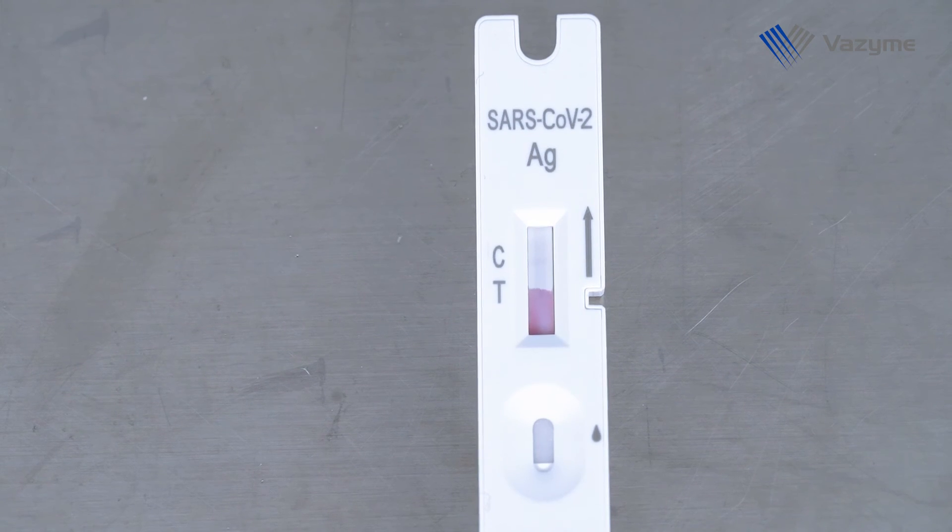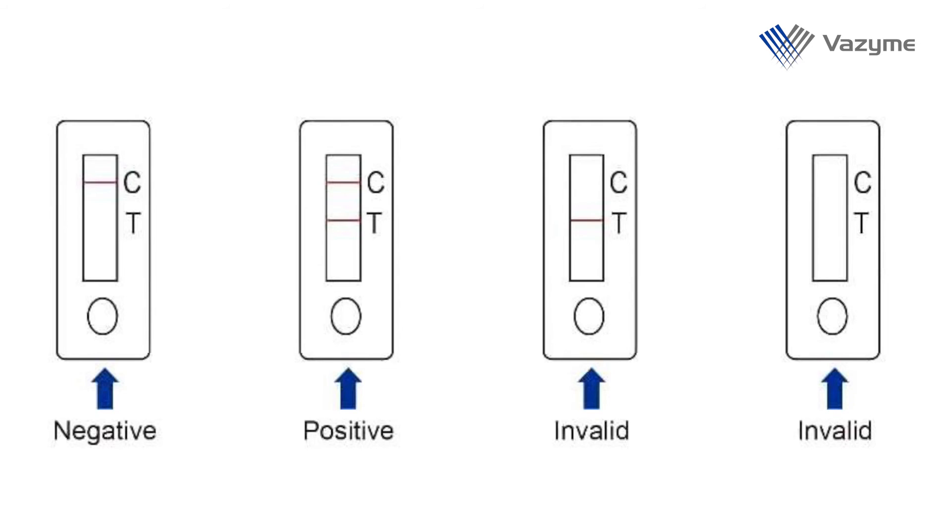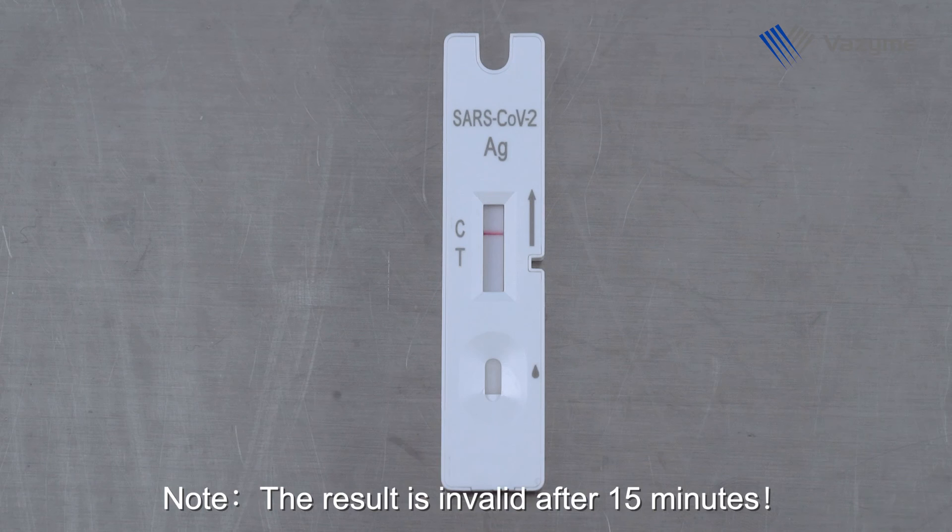Visually read the result after 10 minutes. Note: the result is invalid after 15 minutes.